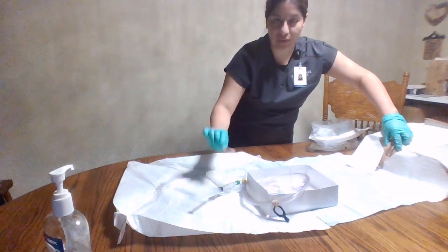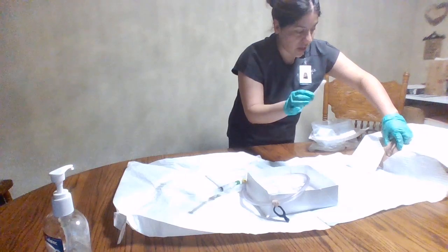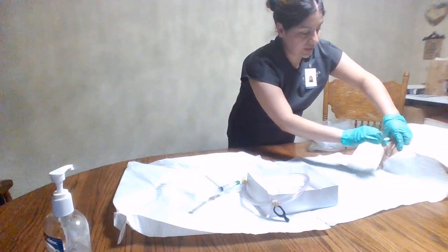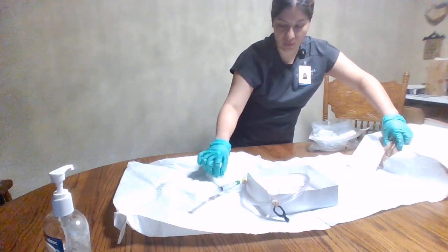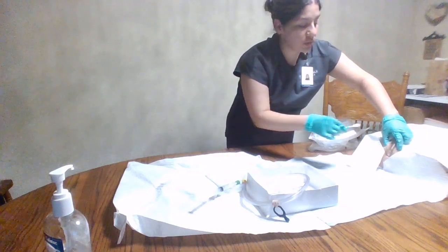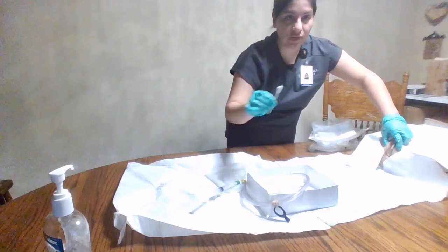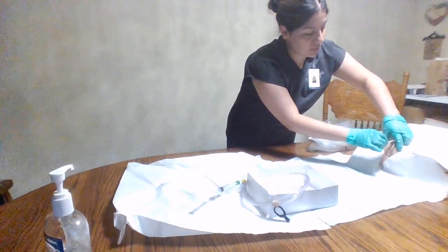So we'll take one of the sterile swabs, and beginning with the labia furthest from me, from top to bottom, I will begin cleansing. We'll grab another, and with the labia that is closest to me, it will go from top to bottom. And with the final swab, I will go down the middle from top to bottom.